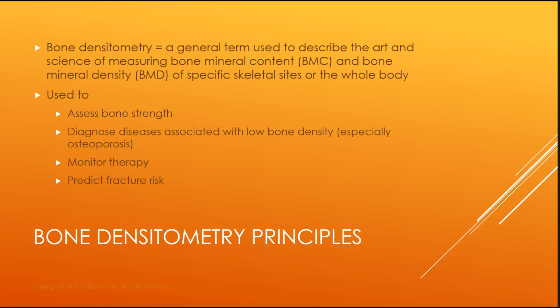It's used to assess bone strength and diagnose diseases associated with low bone density, like osteoporosis. It's also used to monitor therapy. So if you've been diagnosed with osteoporosis and they have put you on medication, you will have follow-up DEXA scans to see how the therapy is doing. It's also used to predict future fracture risk.